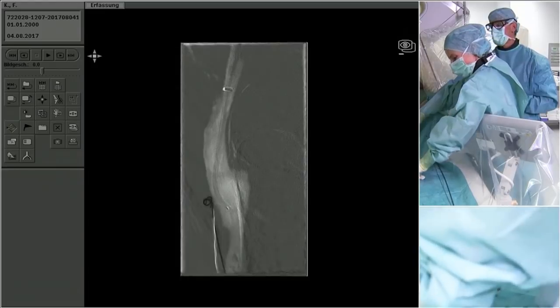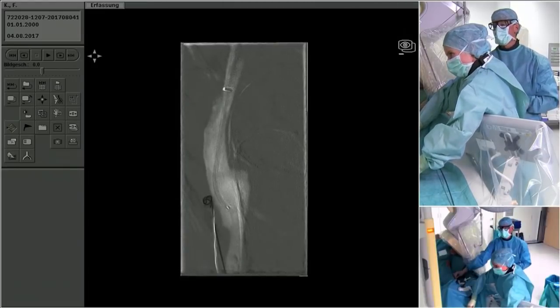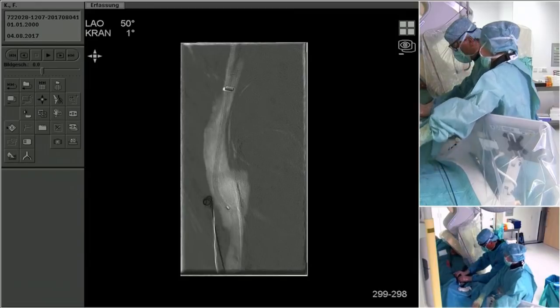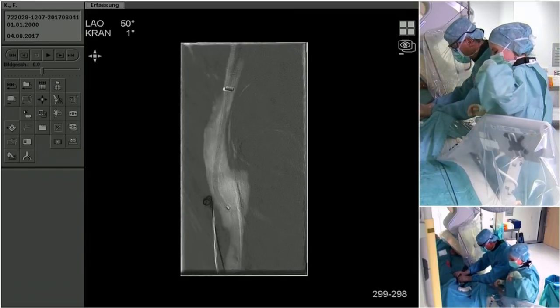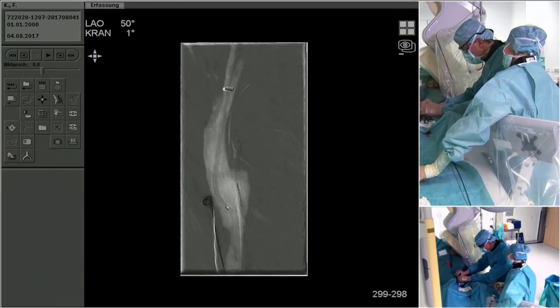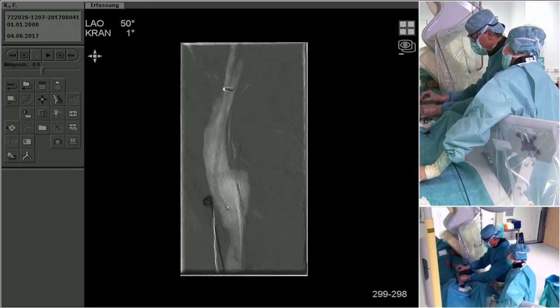Andrej, we don't want to rush you, and please take your time, but just to let you know that we have 7 minutes. That's good. I believe this is maybe too little time to show you everything here. Hopefully the success. So I didn't take the needle off the wire, but just gave it more angle here on that wire.